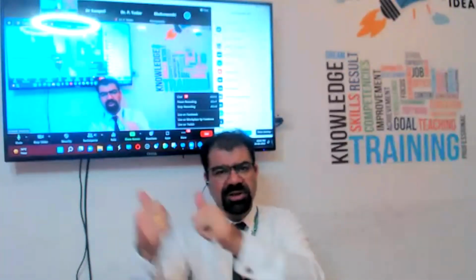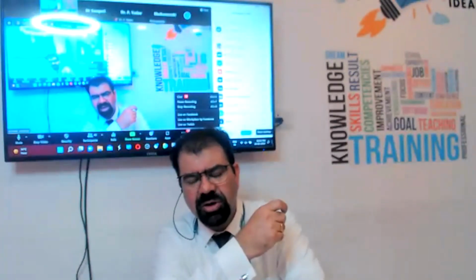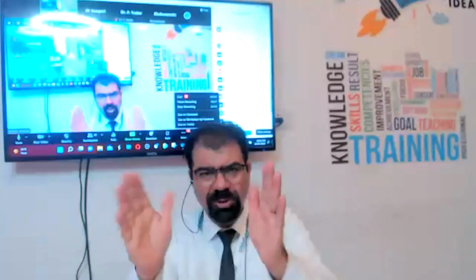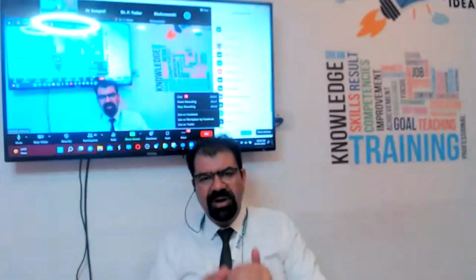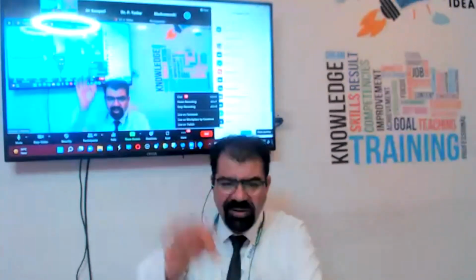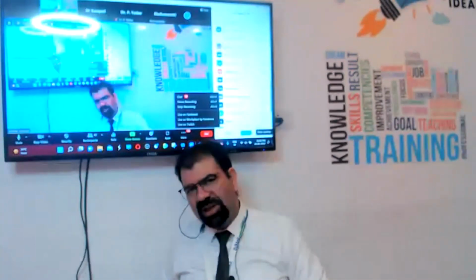Now come to the longitudinal section. What I can take in longitudinal section is first the length, yes or no? Yes, sir. Then where to take the depth? The third measurement is the depth. In both you can take, be it in longitudinal or in the transverse section. But usually we take it in longitudinal section. Then whatever volume will come will be the actual volume of the endometrium. So this way you have to take the volume.